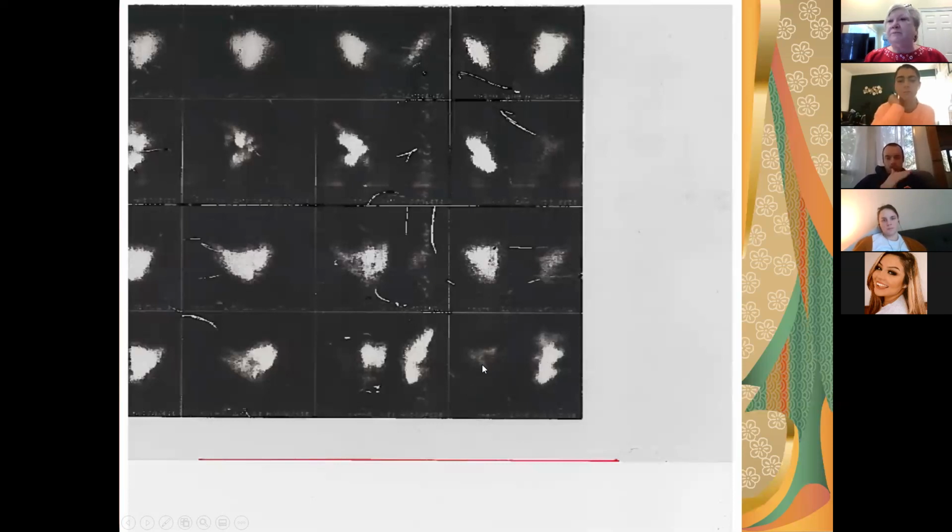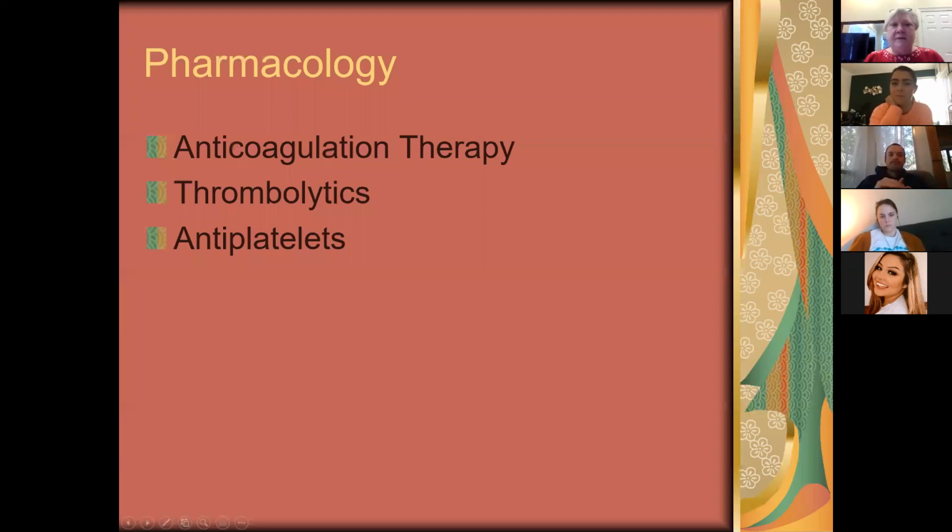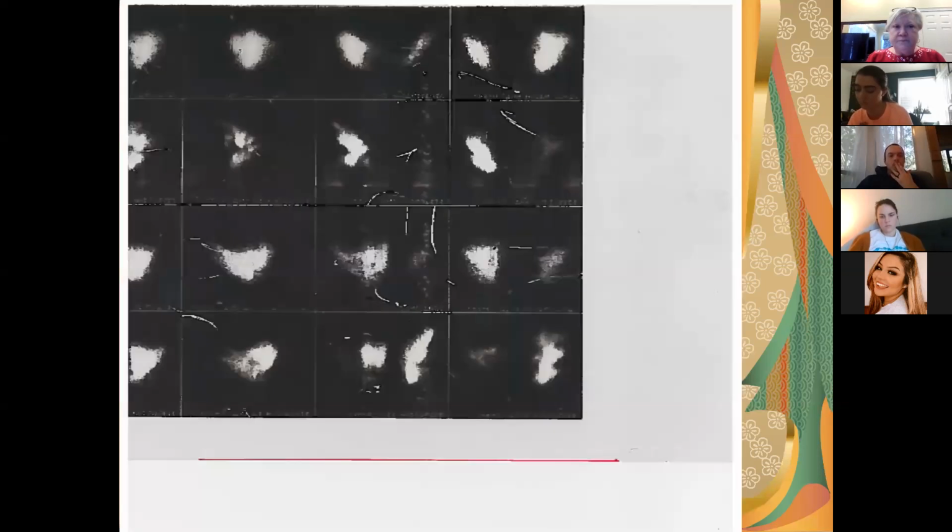So the fact that the radioisotope did not go equally through the vasculature of the two lungs, when this was interpreted by the radiologist, it was interpreted as a high probability of a PE, that there was a blood clot that is blocking the lung field over here on this lung. I don't know why. I mean, I don't know if they flip it or what. I don't know, but it was that lung that was the problem. And that's what a VQ scan was.